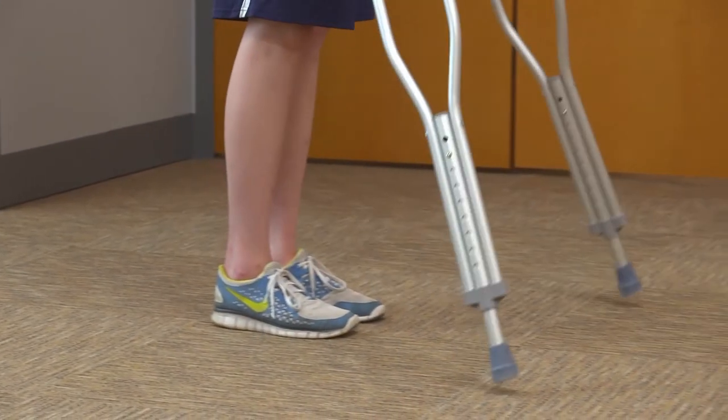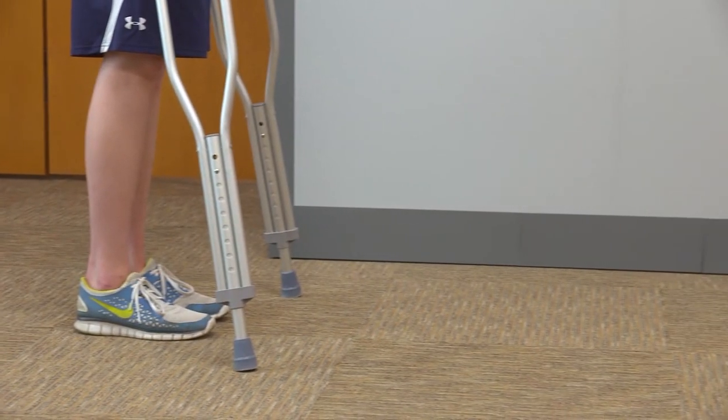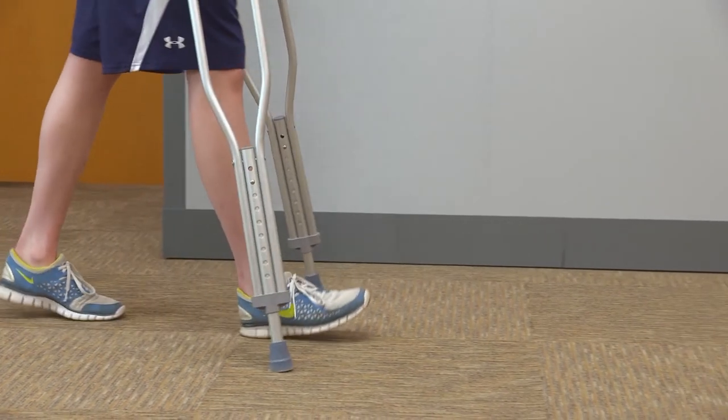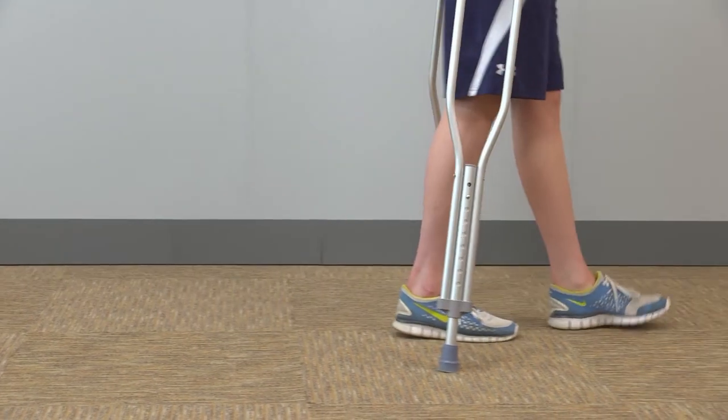As you feel comfortable and confident on the crutches, you may start to move the crutches as you advance the surgical leg at the same time, as long as you tolerate the weight without pain or limping. Work towards achieving a normal stride length.